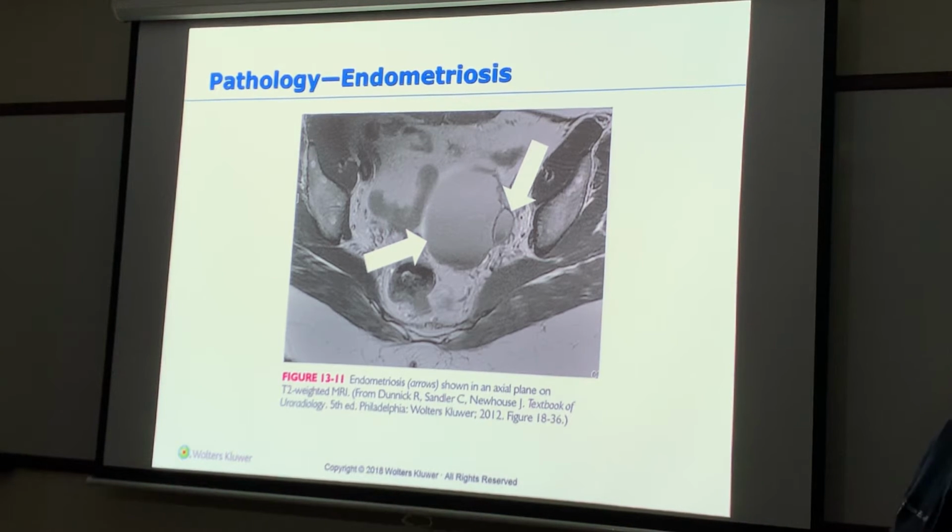anterior, inferior, lateral, medial, you still do the grid evaluation on it. With and without measurements, with and without color. Is that a chocolate cyst? So where would they say that it was, and where's that echogenic? It's only an echo, you have to be at that level to be able to see it.